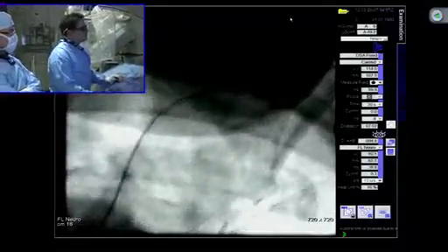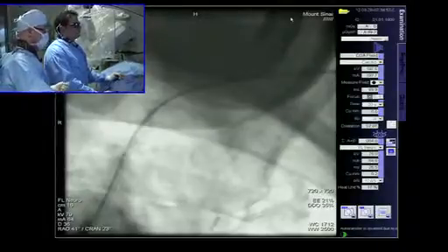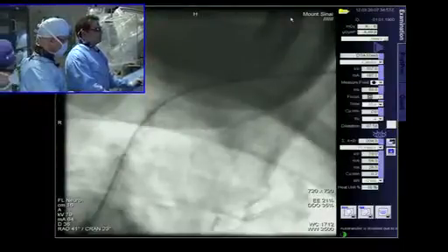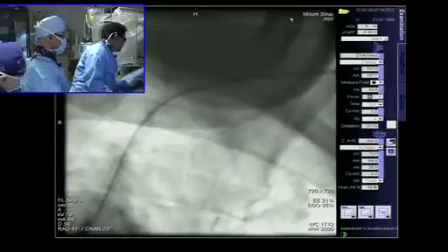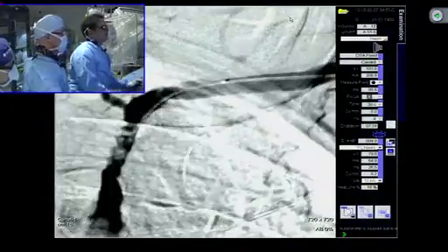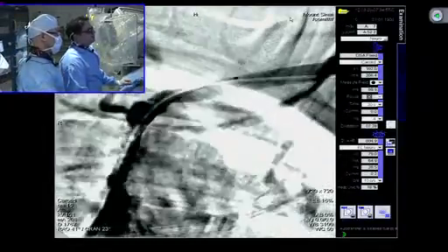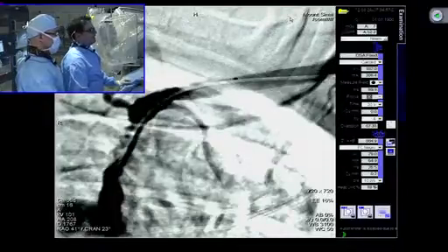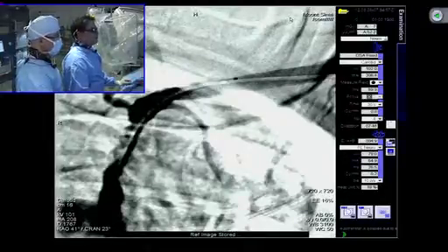In this case, the normal anatomy, the LIMA comes right distal to the vertebral. Yep. So unless you demonstrate that this is a reverse or an ectopic or something like that, if you see the vertebral, you're sort of safe. Right. You also don't cover the LIMA, but particularly in this case we have to be very careful, because this is done for LIMA patency. There you go. That's a better view we took here. We actually moved the catheter closer, and now you can see the vert and you can see the LIMA. Yeah, exactly. So now what this does is it helps you decide on the landing zone, and it also helps you decide what type of stent you need and how much proximal edge you have.